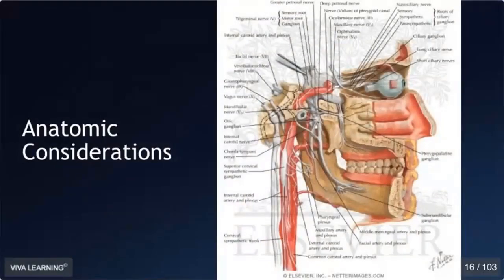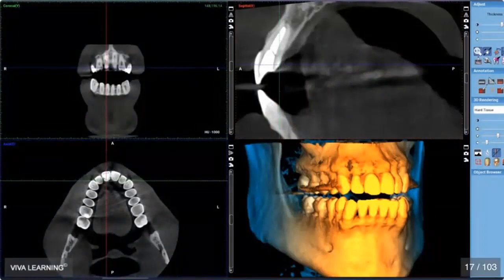And then obviously, we want to make sure that we get this information and combine it with all of those anatomic considerations that are really fundamental to implant surgery and placement. I won't go into those details, but having really good images is very important, so we can see what we're working with when we consider the anatomy in really critical areas: sinuses, adjacent teeth, quality and extent of the bone, location of nerves, fossa, etc. So it's important to think of all these things in combination when we're planning these cases.